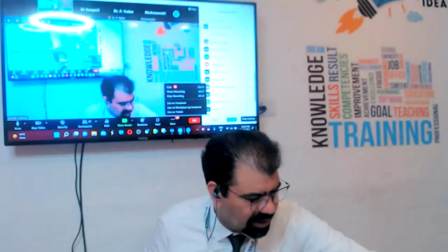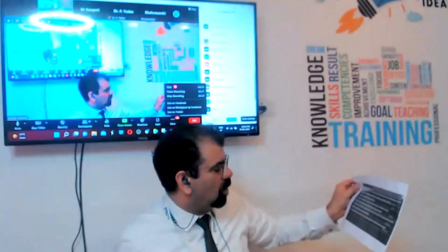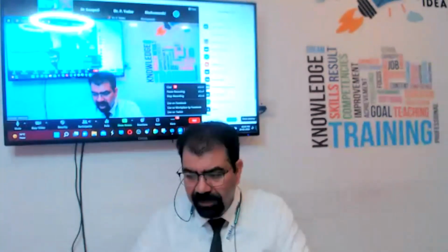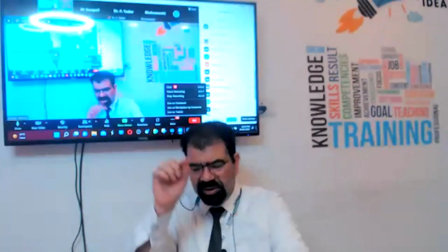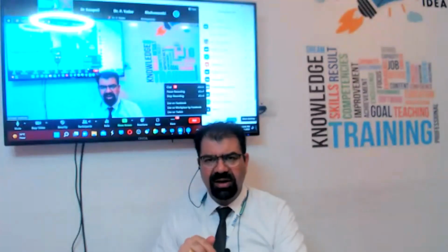Second part of the question is how much should be the peak systolic velocity of the about to rupture follicle. About to rupture follicle, peak systolic velocity should be approximately 10 centimeters per second. Now we are talking of Doppler.